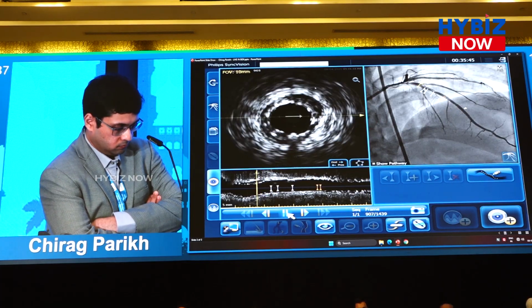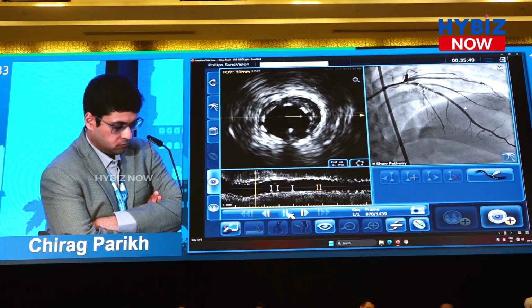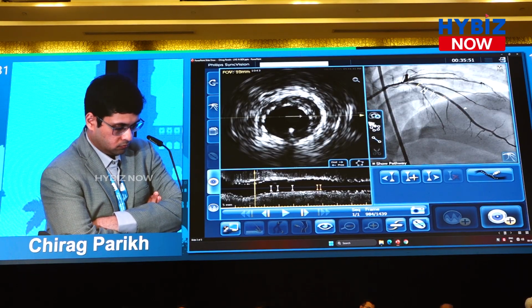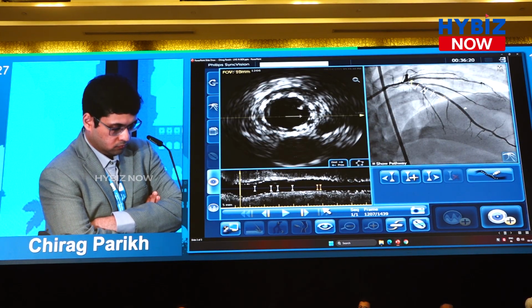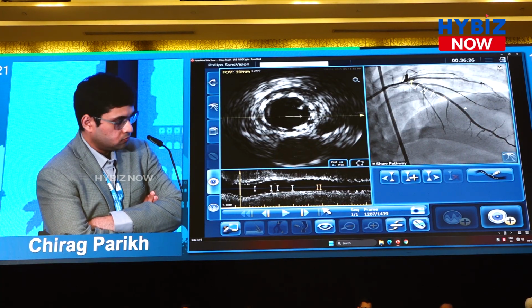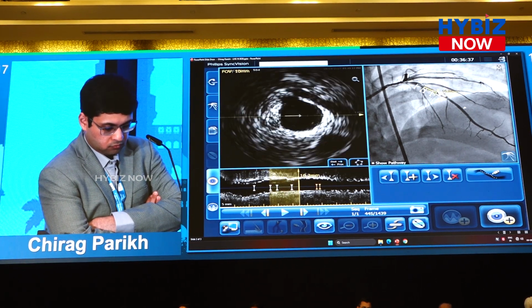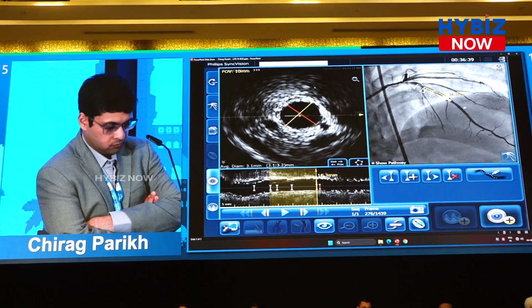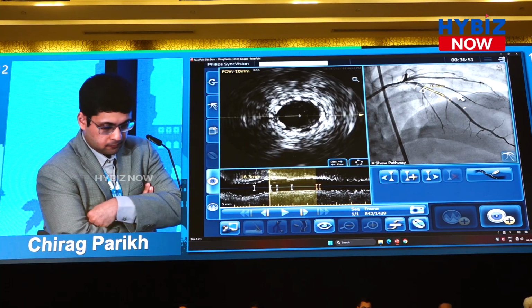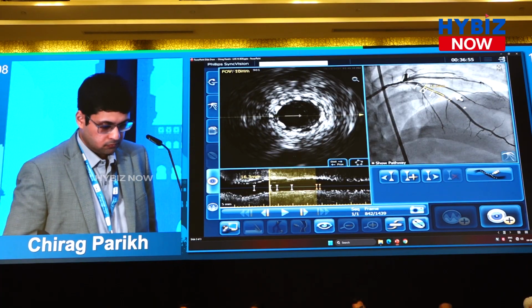Coming more proximally, I think here there is not much tissue, and here the stent appears to be pretty well expanded and apposed. I think based on these IVUS findings, Chinmay, we can put one stent from the septal branch just below the diagonal into the mid LAD. The Syncvision allows you to measure the angiographic length based on the IVUS co-registration. Then we would be okay if we had a 16 or 18 millimeter stent.